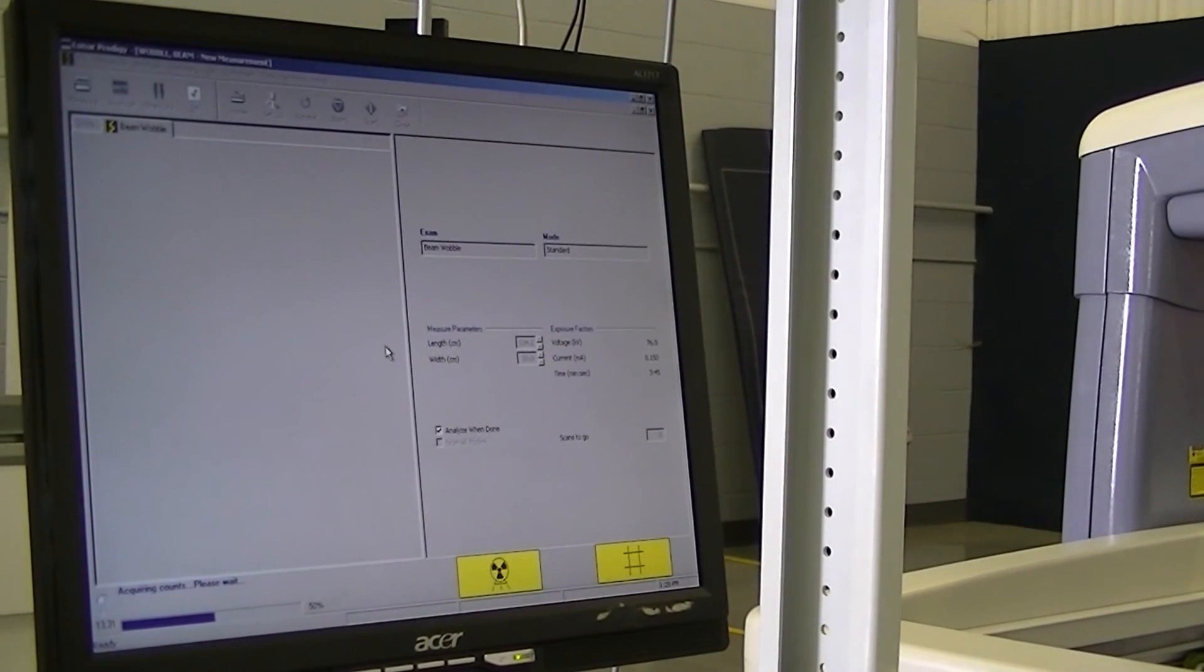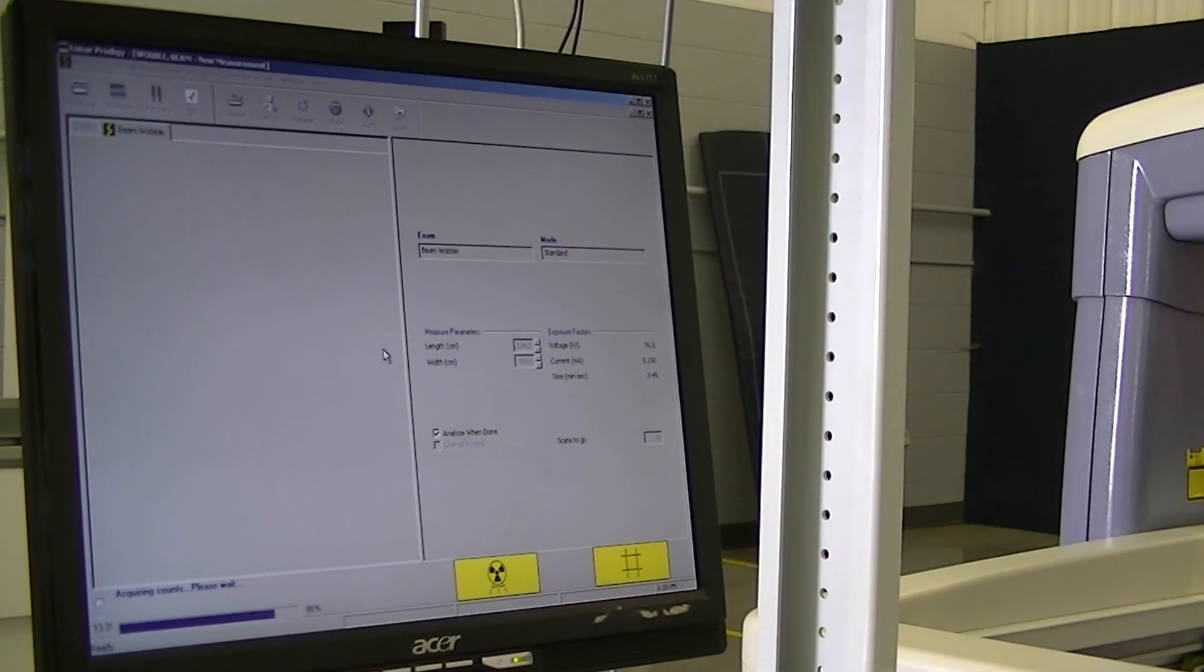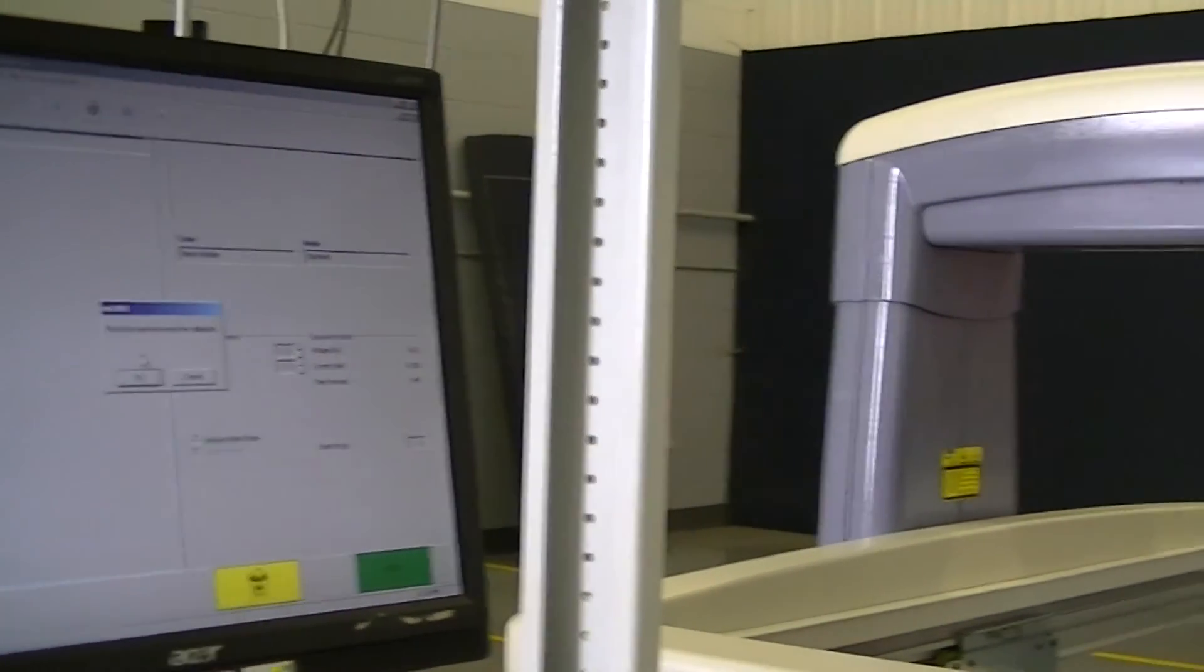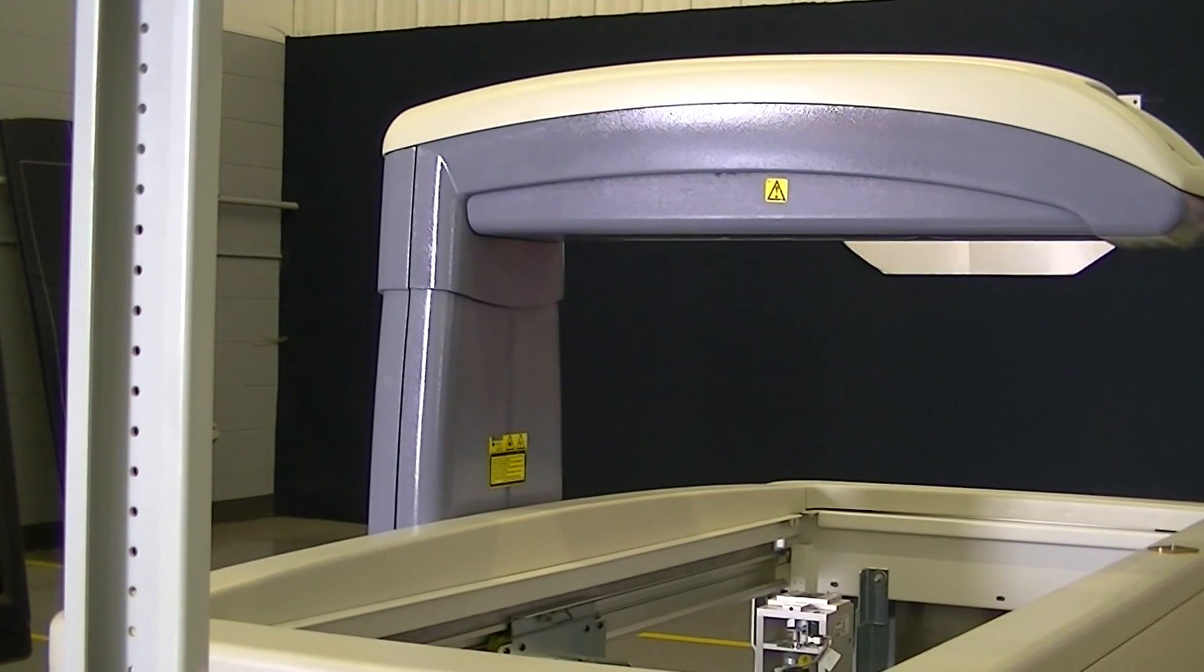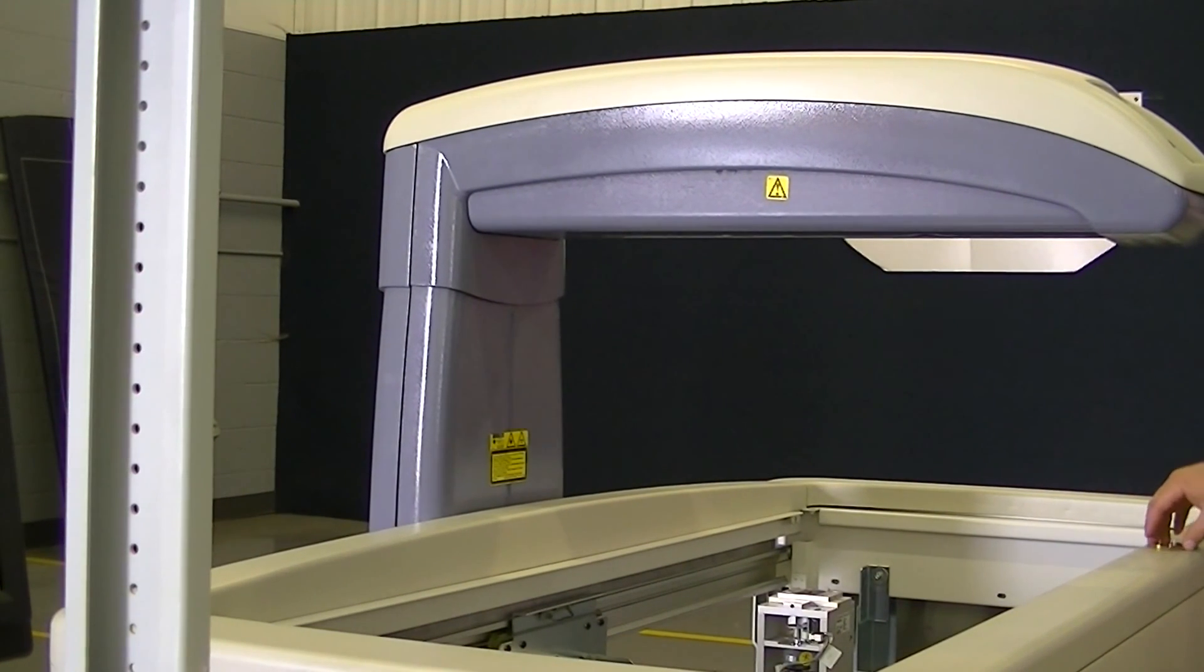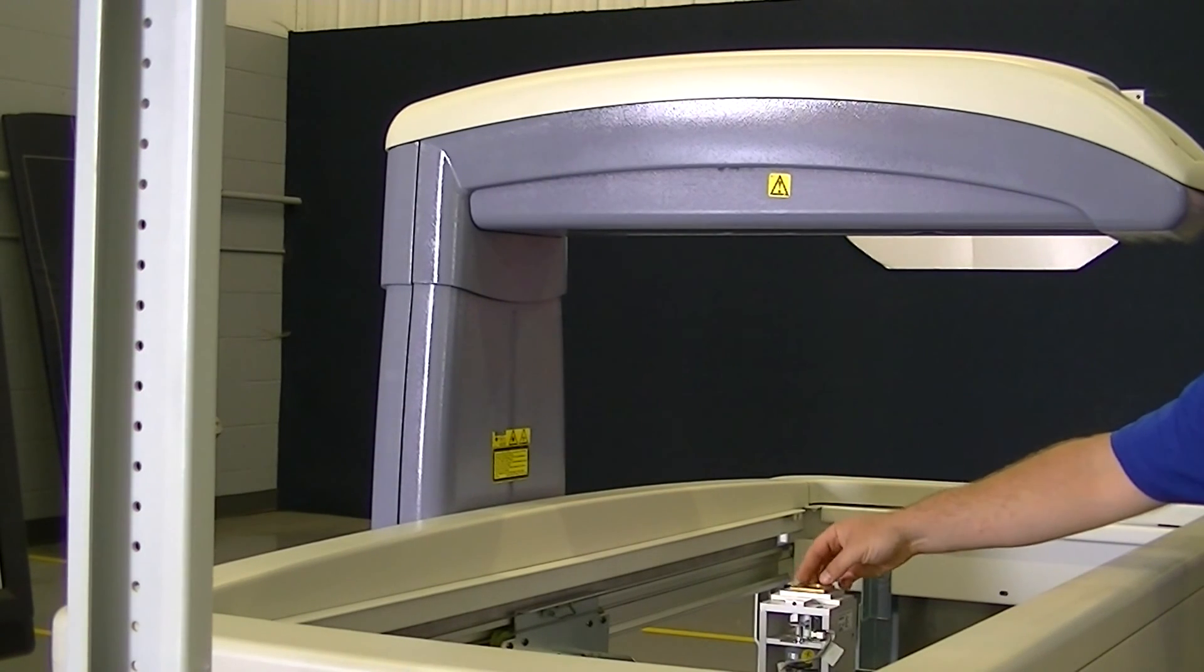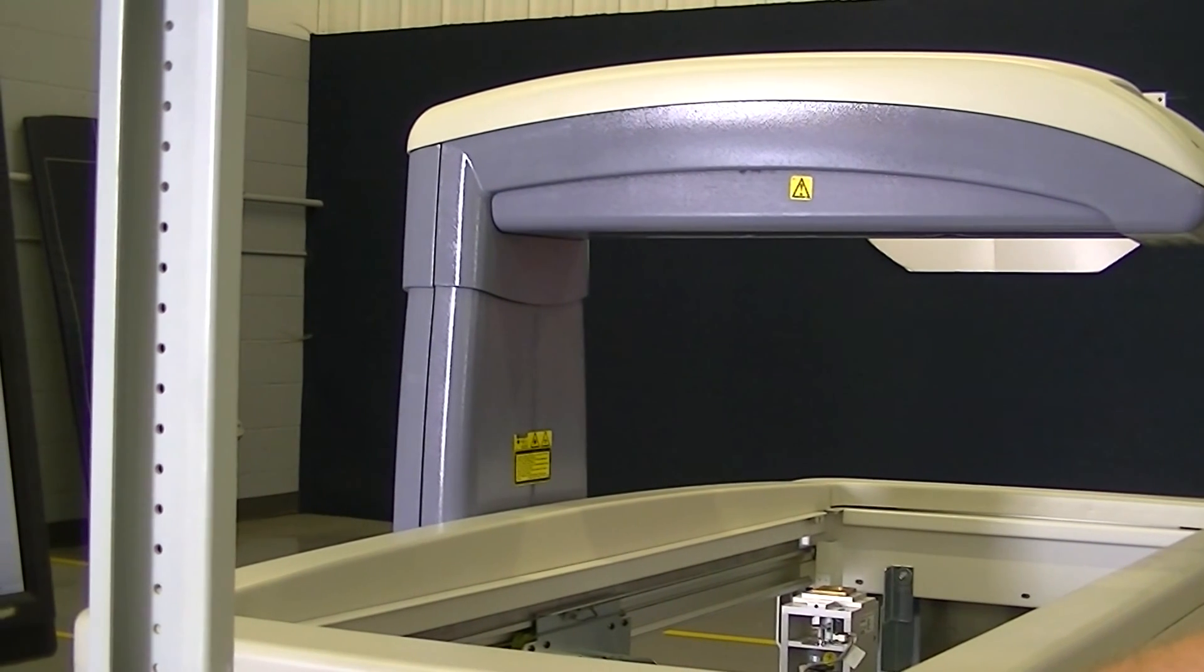The x-ray is ramping. An error will come up and tell us to put the aperture in place. There it is, so we want to put the aperture over the collimator, then hit OK, and the test will begin.